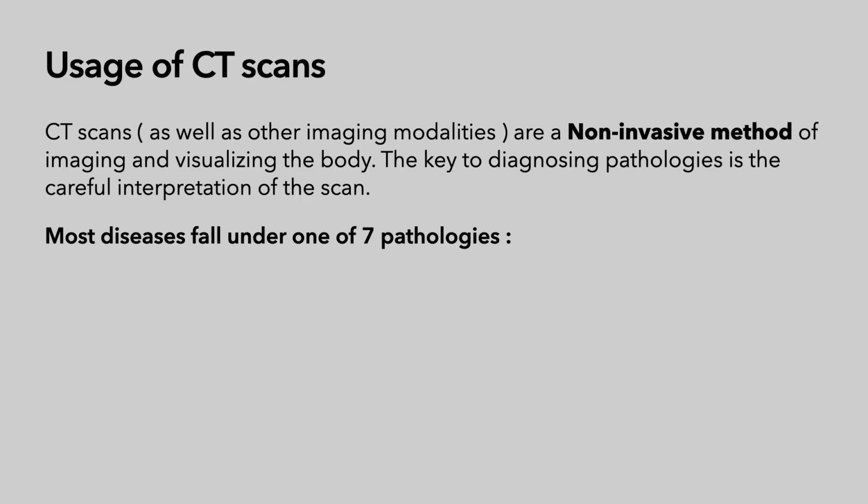The usage of a CT scan is a non-invasive method of imaging and visualizing the body. This is basically the same as the usage of any other imaging modality, trying to get an image of the body without really opening it up. This part is not really important.